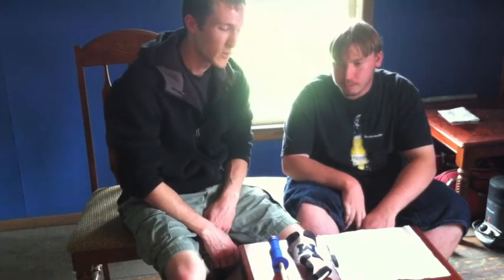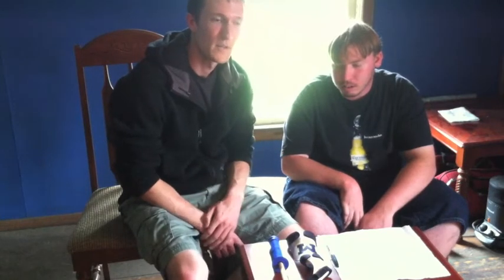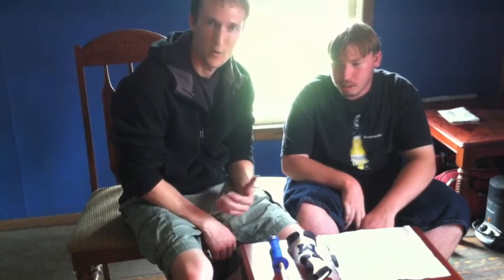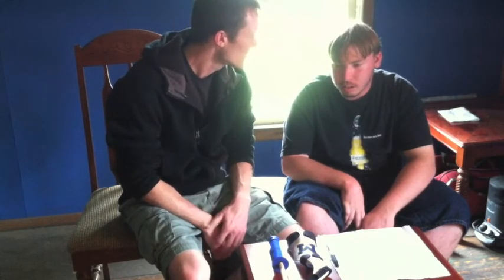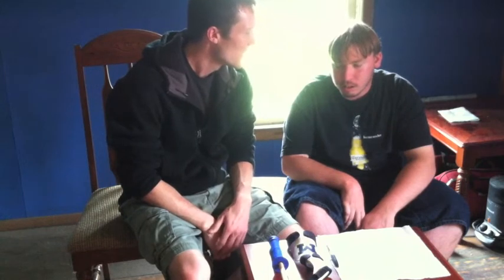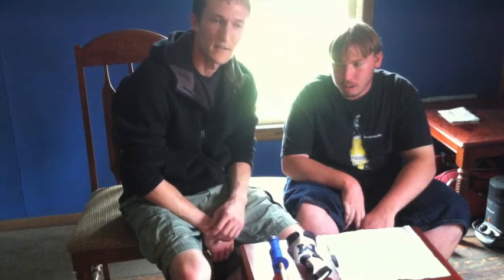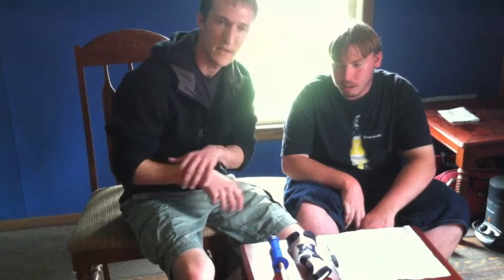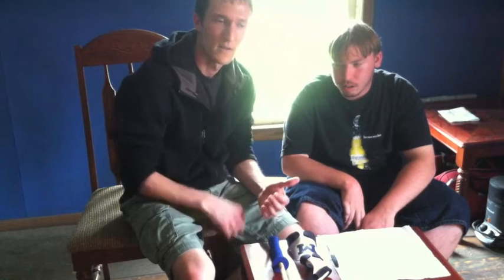So with that being said, you guys, I wanted to create a splint for Nick. I know he has his uncle Dan, who has been a big influence in his life, and he's always played the drums growing up and has been in various bands. So that's an activity that Nick has been trying to learn how to do, playing the drums. Nick indicated that sometimes he has a hard time gripping the drumstick, or the drumstick will fall out of his hands because of the spasticity issues that he has. And therefore I wanted to create a splint that would help support that.